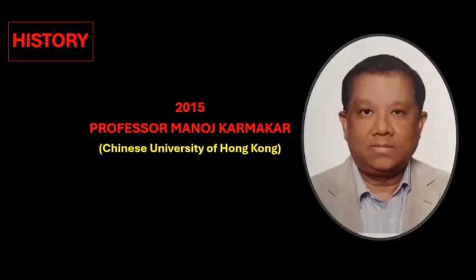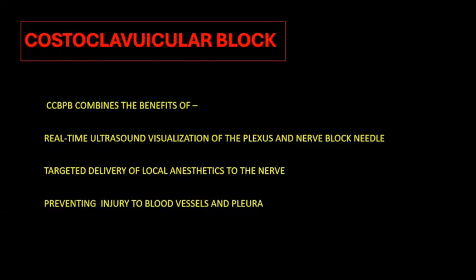All credit goes to Professor Manoj Karmakar from the Chinese University of Hong Kong, who in 2015 described the costoclavicular space and the costoclavicular block of the brachial plexus. The costoclavicular brachial plexus block combines the benefits of real-time ultrasound visualization of the plexus and the needle, and targeted delivery of local anesthetic to the nerve, thereby preventing injury to the blood vessels and pleura.